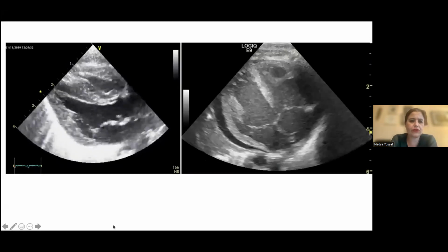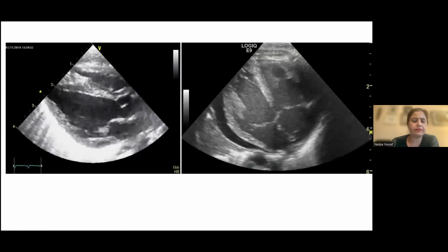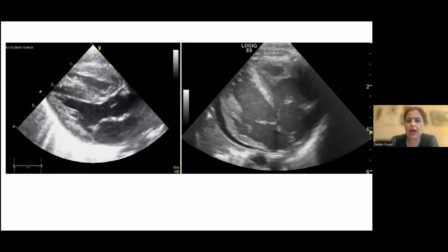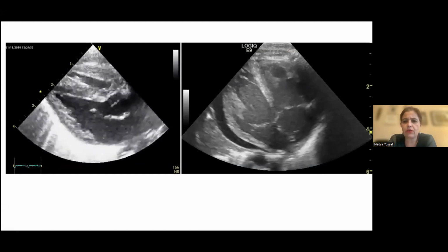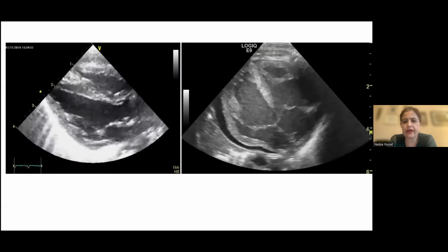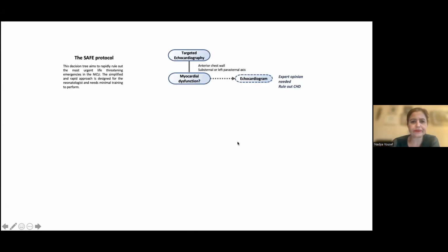And if we prefer to use the parasternal axis, this is a heart that is contracting. The problem here is not gross myocardial dysfunction, and whatever is going on is not affecting myocardial contractility as compared to the heart on the right. We all agree that this does not look good. This is a very severely depressed heart for some reason, and in addition, here we can see there is an effusion.